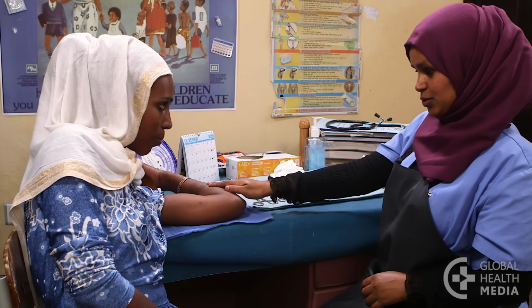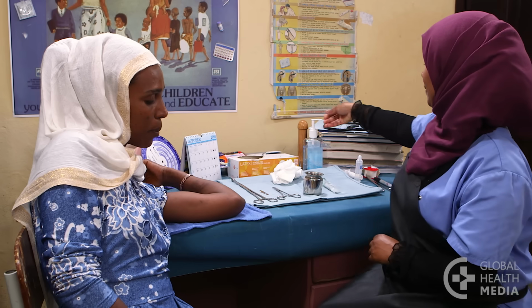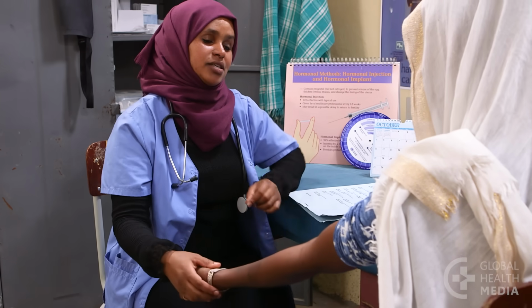The best approach causes the least trauma to the woman's arm. Explain the procedure to the woman. If she wants to continue using the implant, a new one can be inserted through the same incision. Preparation is similar for all approaches.